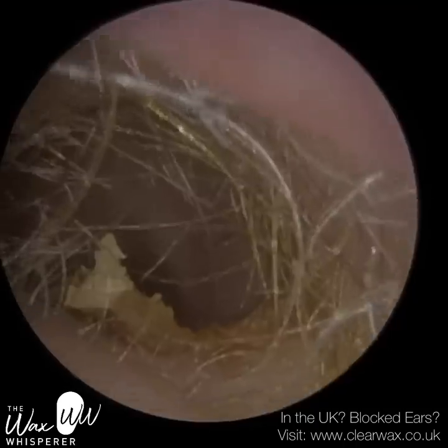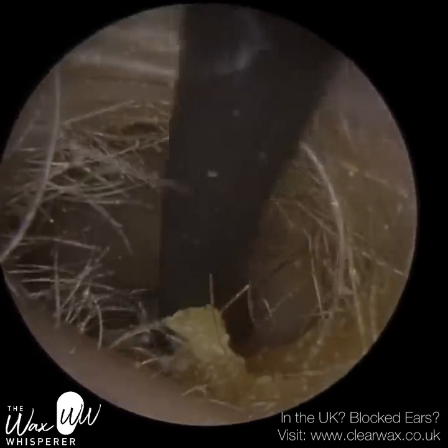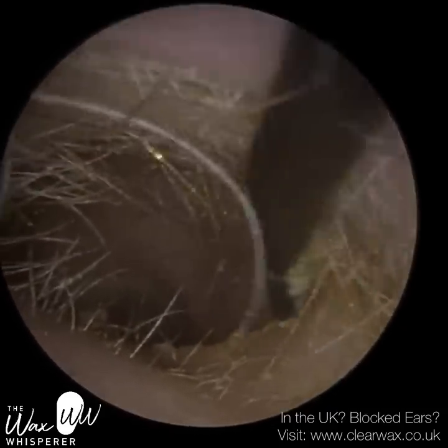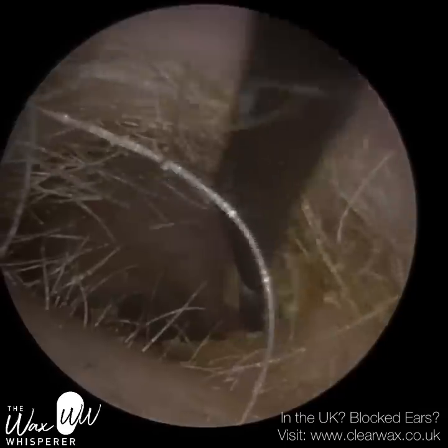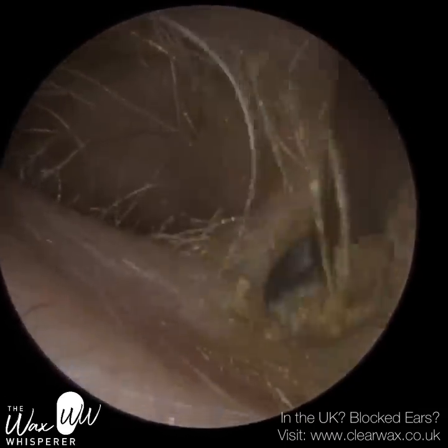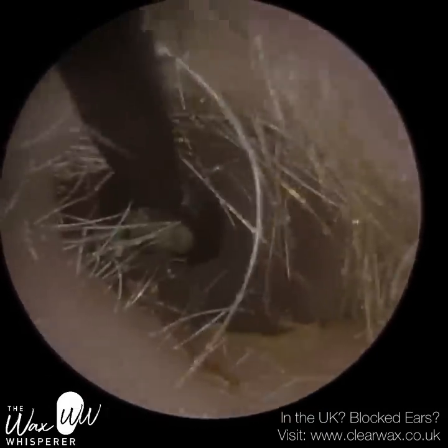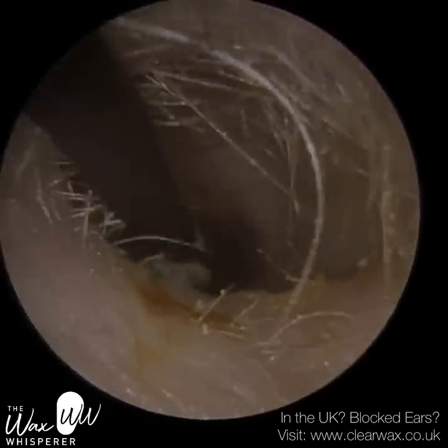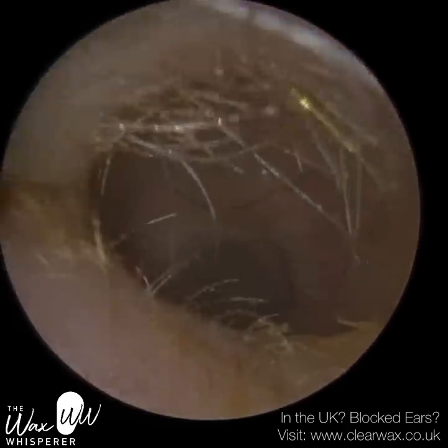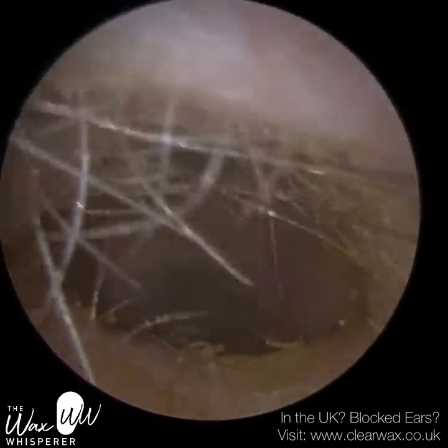What do we recommend to the patient? We wouldn't really recommend trimming these hairs because they're in the outer third — that's the region where the hairs should be — but trimming means entering the ears, and the trimmed hairs could fly deeper into the ear. And they're only going to grow back. You trim these hairs, they'll be back soon enough. So it's a short-term fix. There are some patients where I do pluck them at the appointment, because we just can't see beyond them, but we don't have to do that with this particular patient.